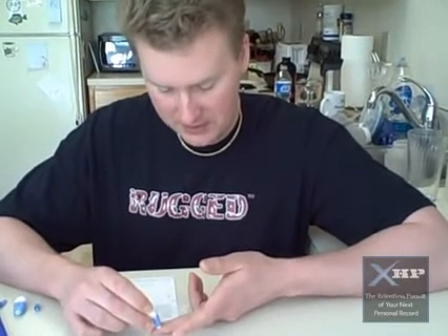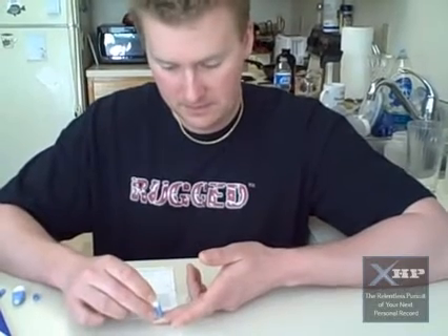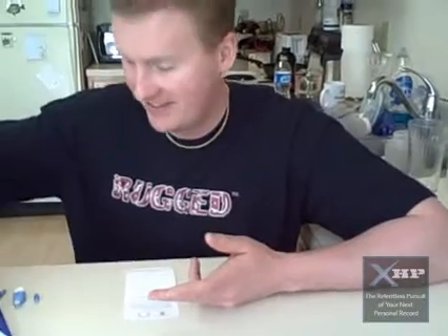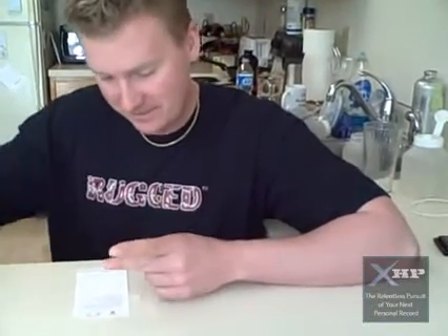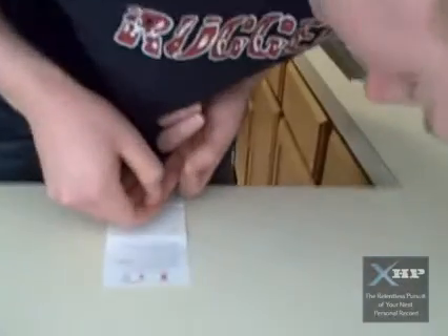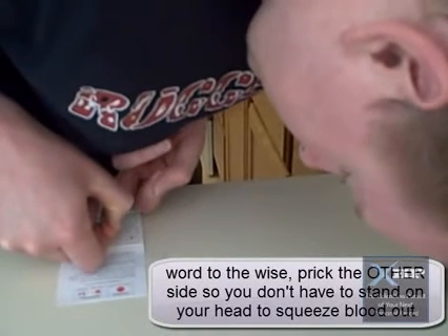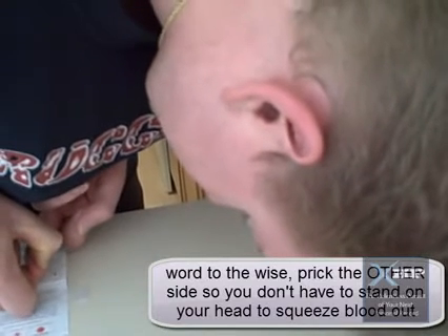It says just push it right on the side. Dang it. Alright. I'm fine. Alright, I'm fine.